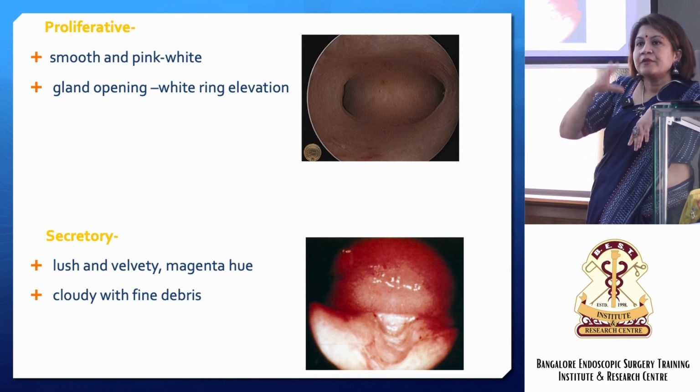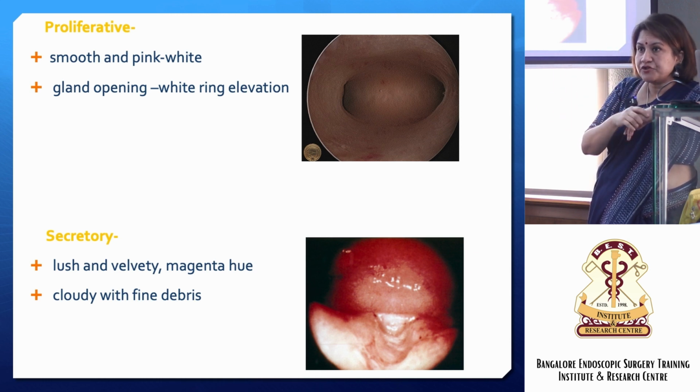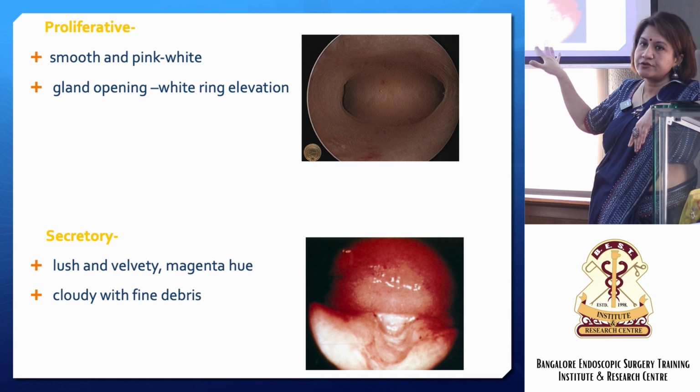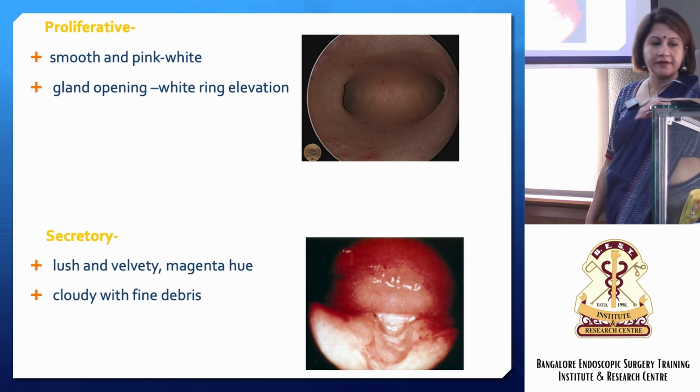In the secretory phase, the endometrium will be much thicker. As you are entering, it will lift up the endometrium, and the media is also quite cloudy. That is why, given a choice, we do not prefer to do hysteroscopy in the secretory phase.